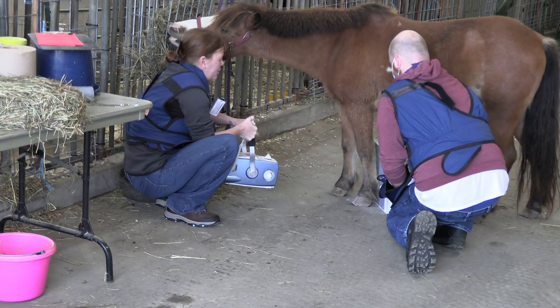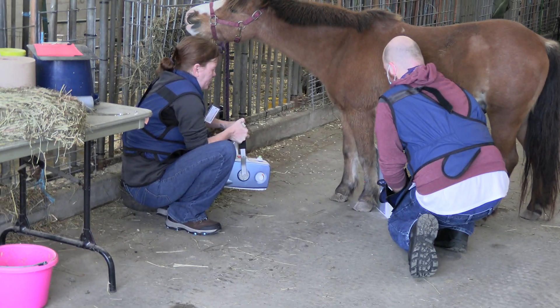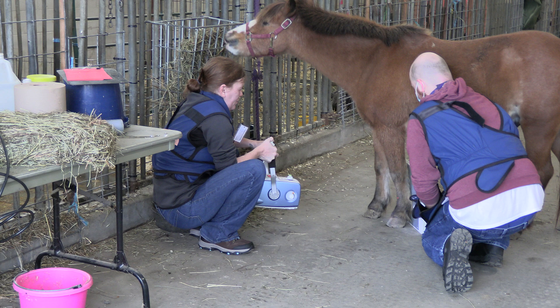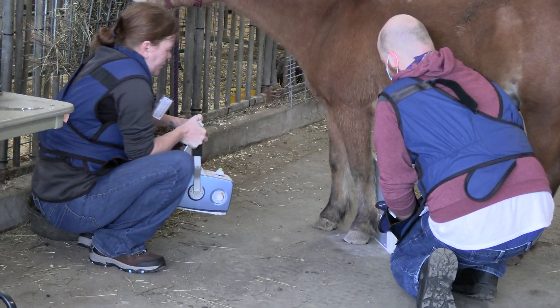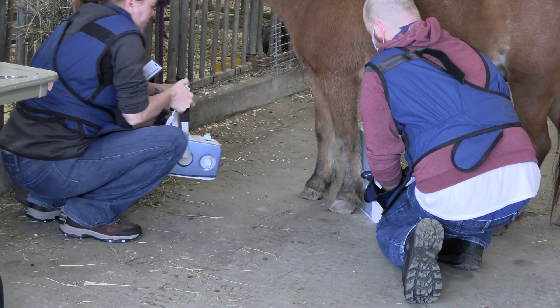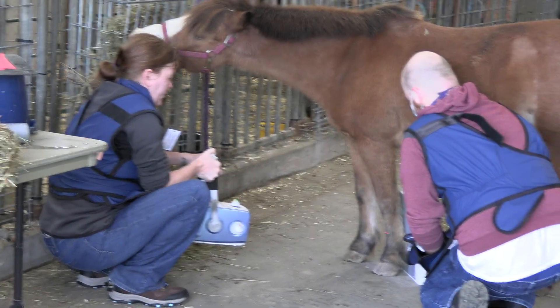Make sure your distance is correct from the plate. Put the two dots on the plate — the two red dots go on the actual plate, not on the leg. Come back just a little bit to help yourself out. There you go, right about there. Now you're going to put your crosshairs where the other crosshairs are.